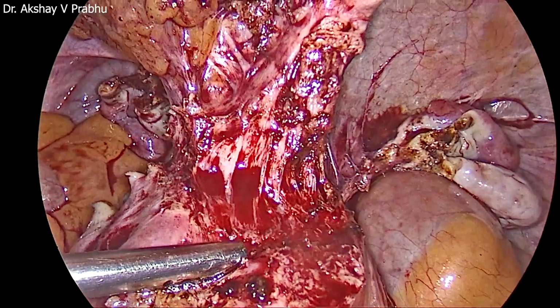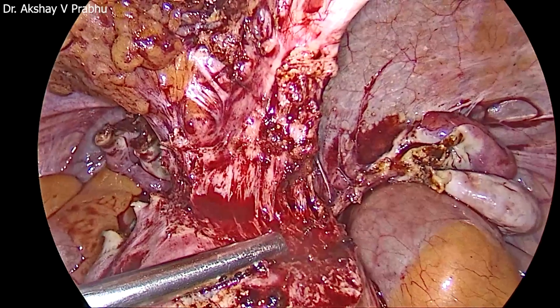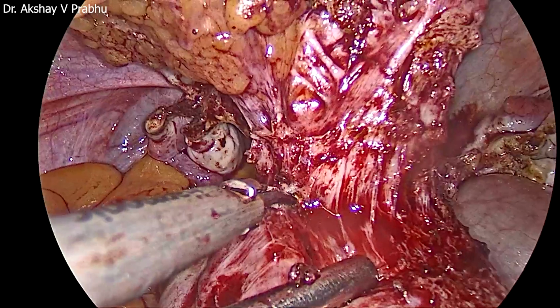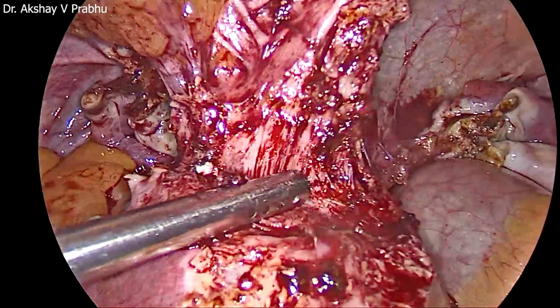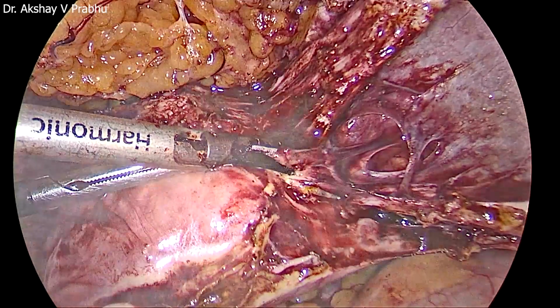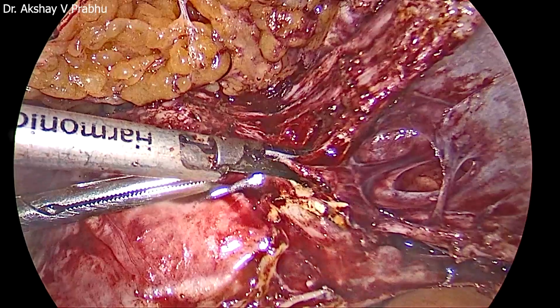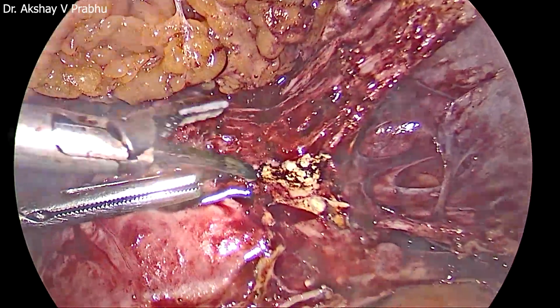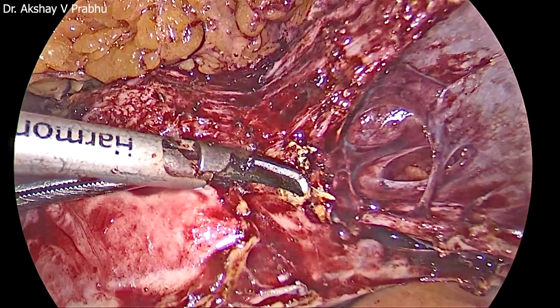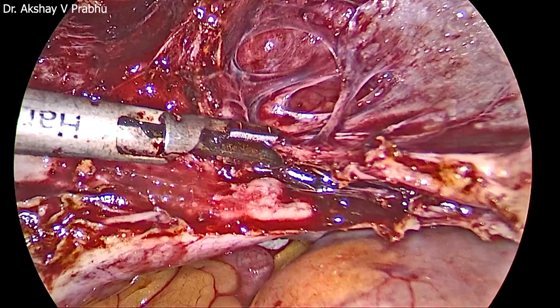So if you can see, that is what I was exactly telling earlier. If you go too much into the uterus, there will be bleeding. These are the venous plexuses which are there in the uterine serosa. Once you reach that level, if you're too much into the uterus, it will keep on continuously bleeding, oozing out. And however much you apply cautery or energy sources, it's not going to stop. It will keep on oozing. That gives you an idea that you are too much into the uterus. So you can again stay a little away from the uterus so as to prevent that bleeding. Good.